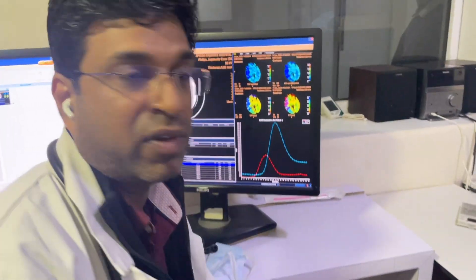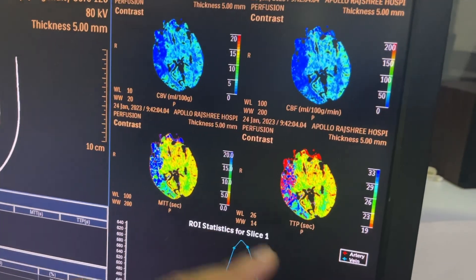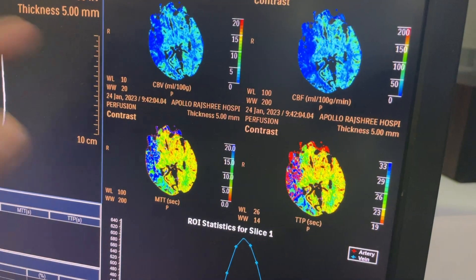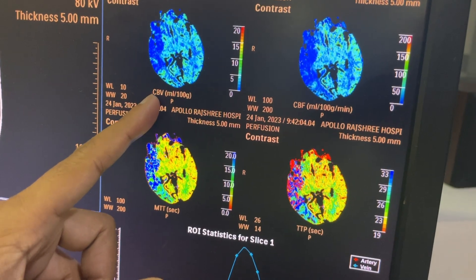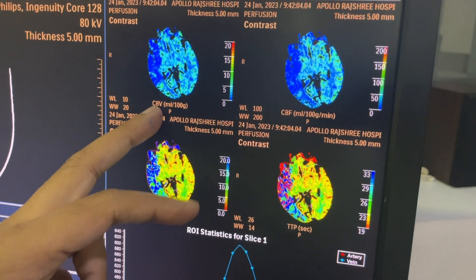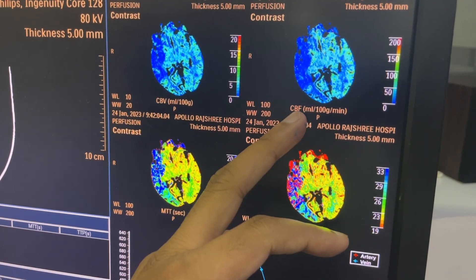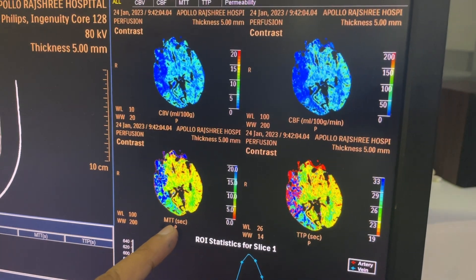We'll try to explain this so that when you get a CT perfusion scan report, you are at least able to identify what is going on with that part of the brain. This is a cerebral perfusion scan image. You can see four terms here: CBV means cerebral blood volume, CBF means cerebral blood flow, MTT means mean transit time, and TTP means time to peak.